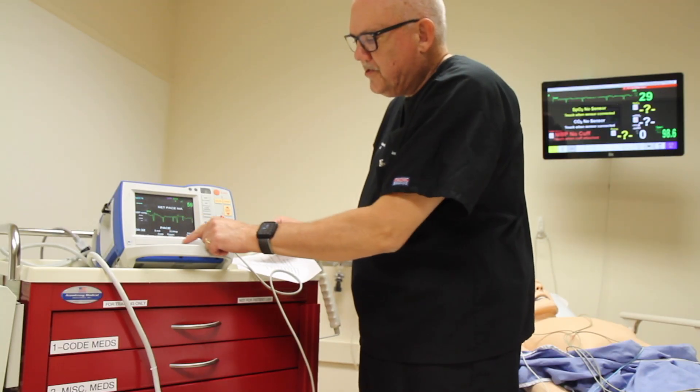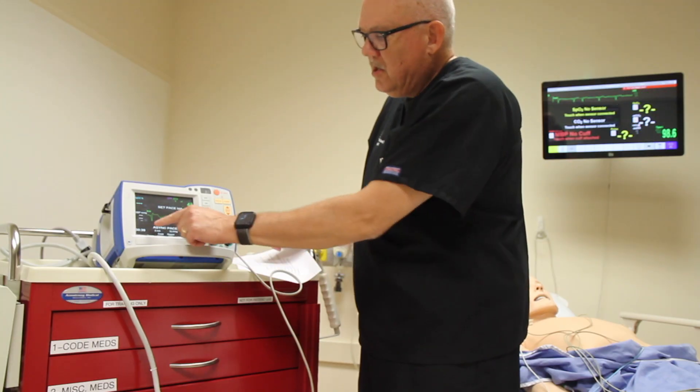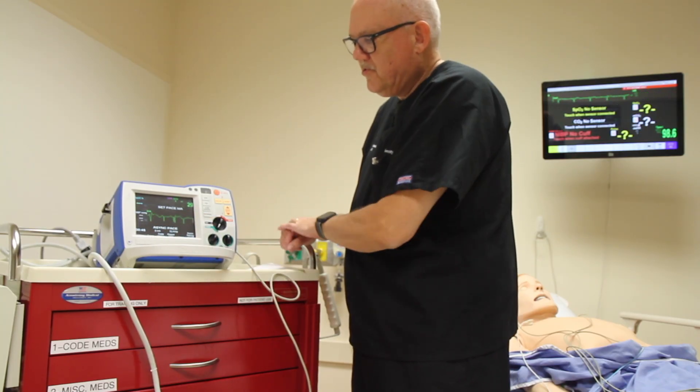Next we're going to use the soft buttons at the bottom of the screen to turn on the asynchronous PACER by pressing the soft button. Look for confirmation that you've activated the PACER when it says asynchronous pacing toward the bottom of the screen.